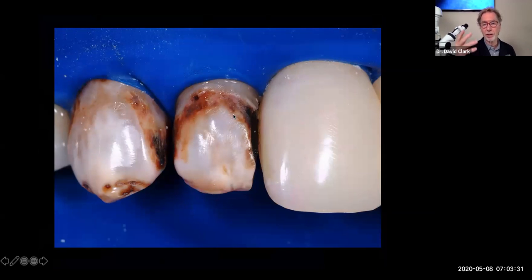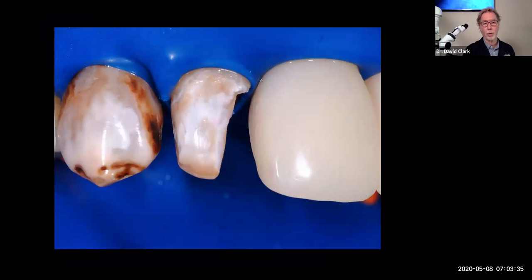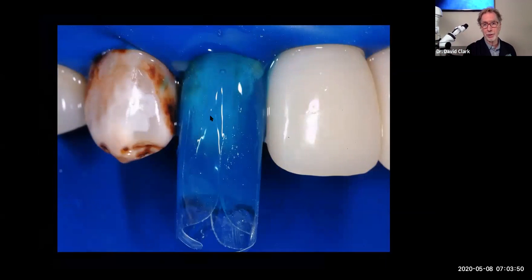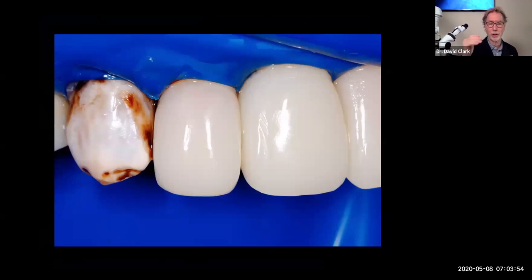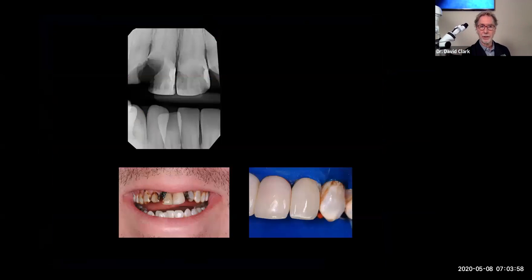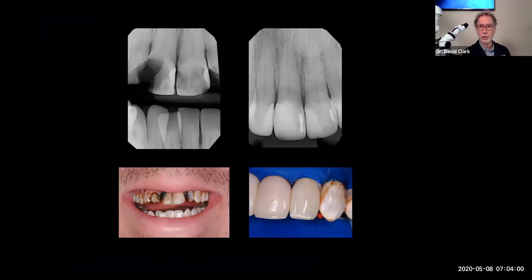You cannot bond to aprismatic enamel. So what we're going to do is skim away some of the aprismatic enamel, put a good rubber dam on, and push the soft tissue away to find good enamel up here. I can bond to normal enamel, but not aprismatic enamel. That's going to have an iffy bond. We just shrink wrap the tooth. There's the umbilical cord. We showed it last time. We can do this. You can do these quickly now if you understand the Bioclear method. And there we go. And there's the postoperative.